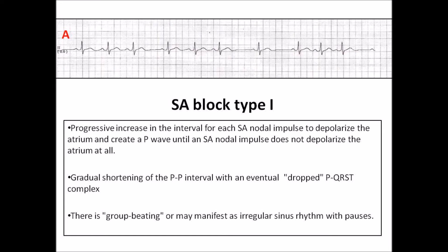In this strip, there is group beating and shortening of the PP interval, and then a dropped P-QRST. There is no evidence of P-QRST complex on all the leads that can explain the sudden bradycardia.